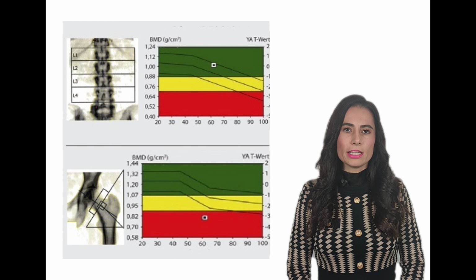In this context, a study published last year examined the difference between the T-scores of the spine and hip using REMS and compared it to DEXA. This study found no cases of significant differences in T-scores in patients examined with REMS, unlike DEXA, where studies showed that 2 to 17% of people examined with DEXA have a difference in T-score between the spine and hip greater than 2 standard deviations. This indicates that REMS is a more accurate method than DEXA, as the likelihood of errors related to artifacts, positioning, and software is minimized.